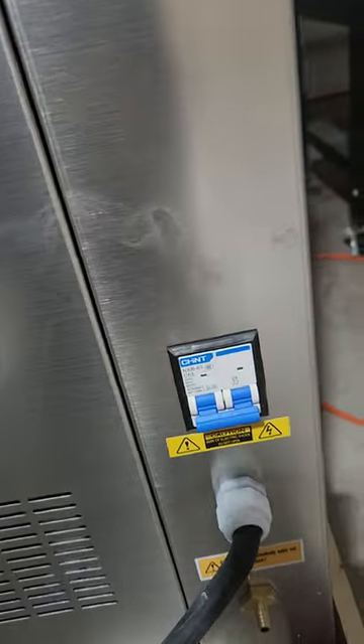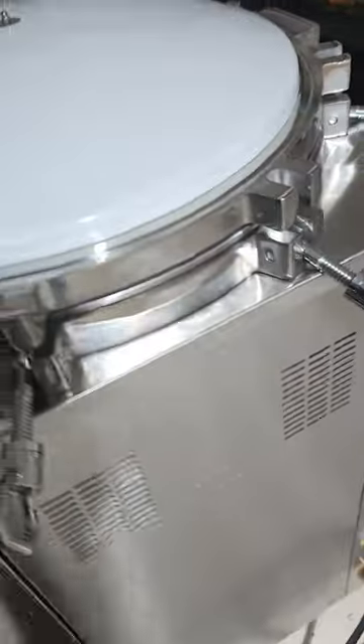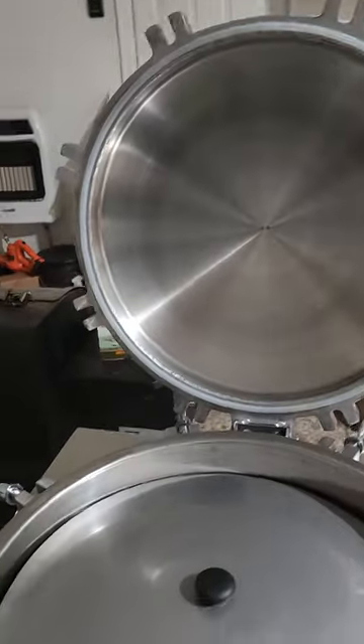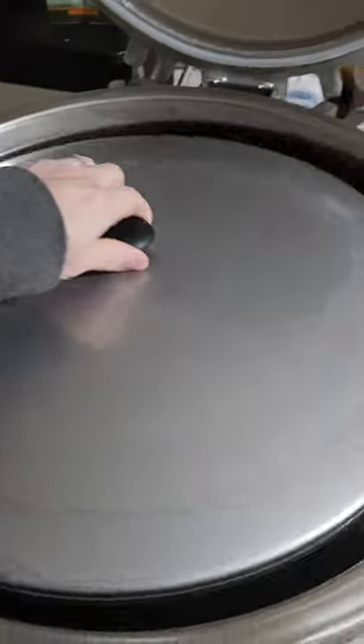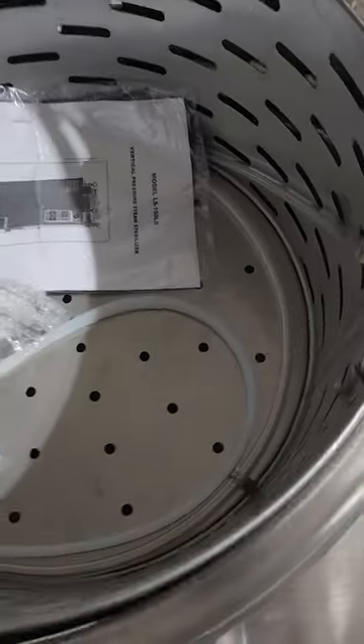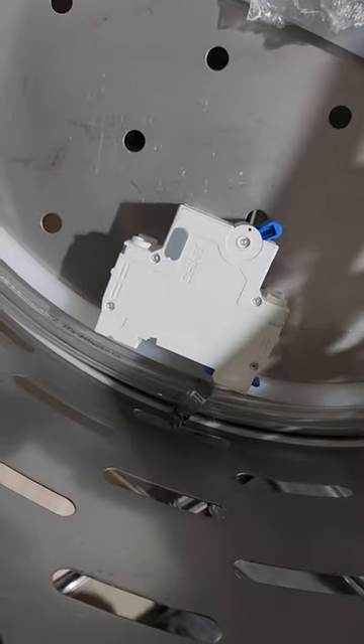Electric panels. Breaker. Big heavy lid. Comes with a dual basket liner. Another breaker.